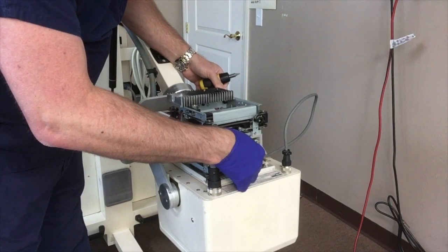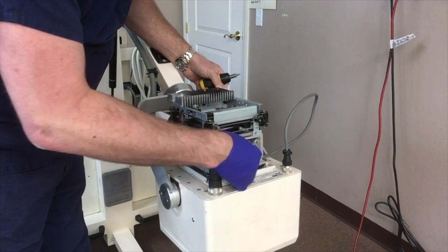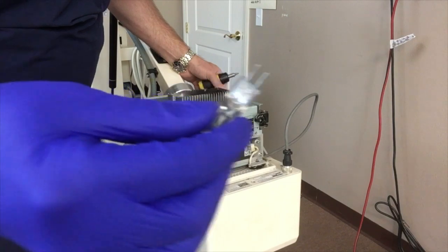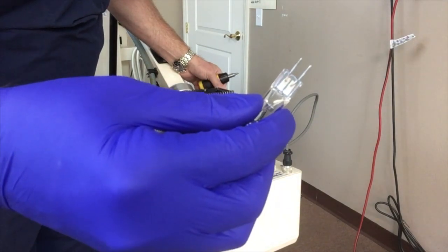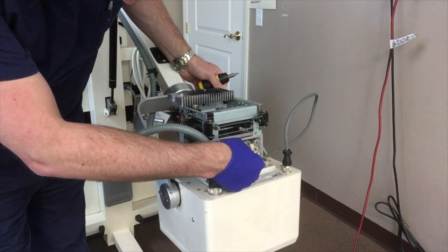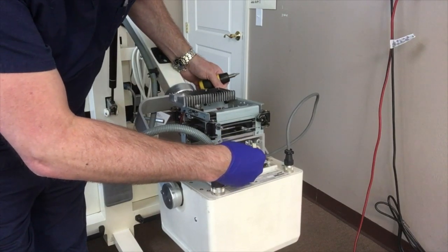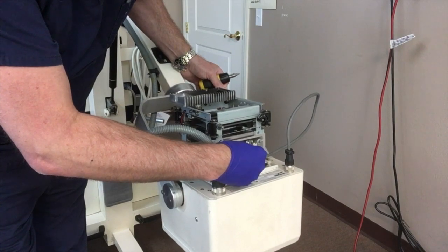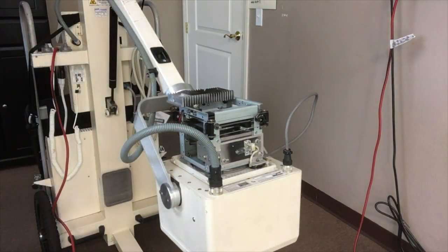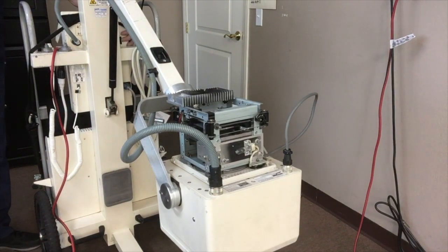The bulb just wiggles loose. It's got two wire connectors that hold it in place. Once you wiggle it loose, get your replacement bulb and just wiggle it back into place. That's all there is to replacing the bulb.